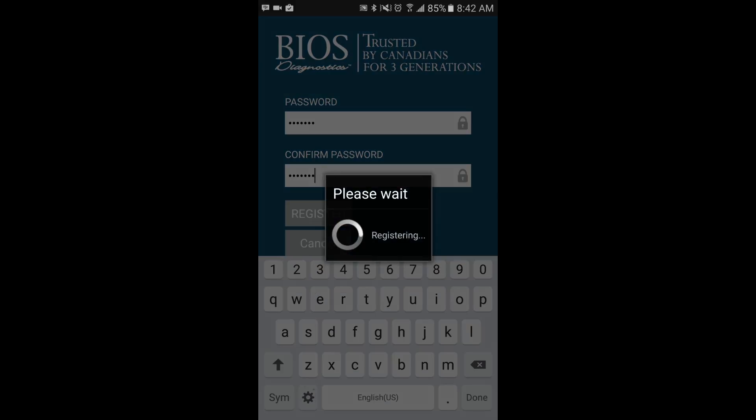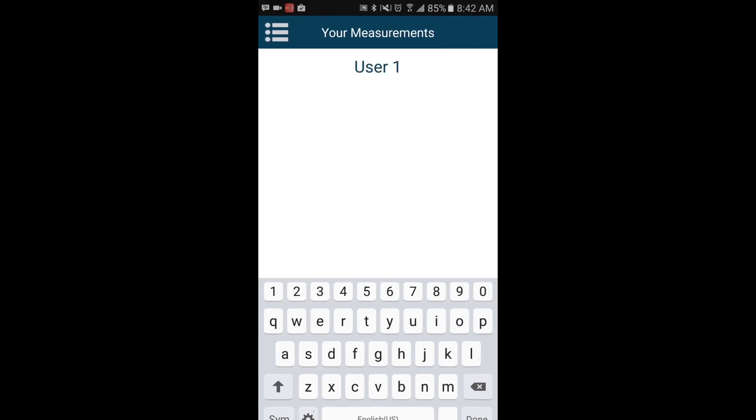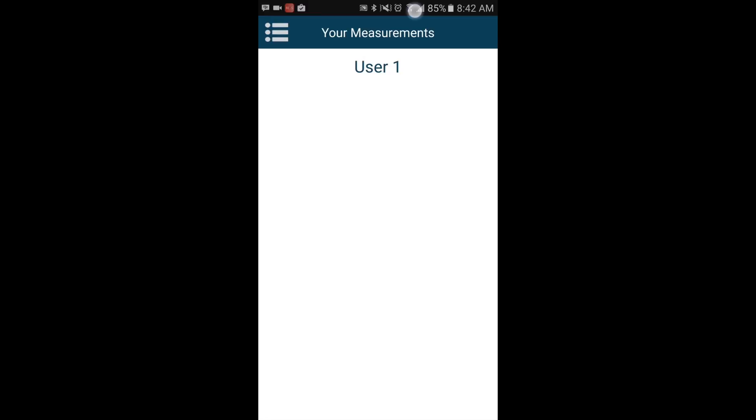Next, select the Register button. Once you are successfully registered, you will be brought to the home screen of the app.